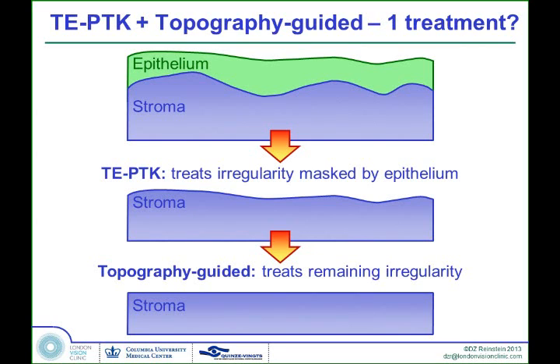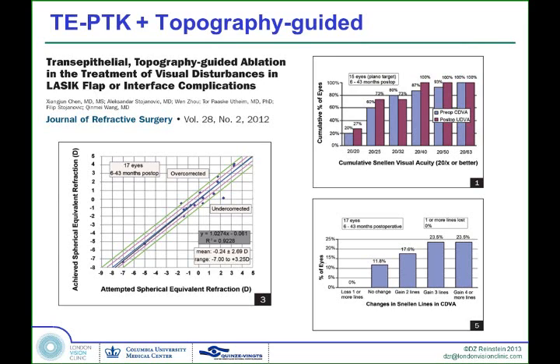This is the Alex concept, and it's good. And in fact, he's published his results. This was last year, and the results are great. I mean, he has good refractive accuracy and good outcomes.